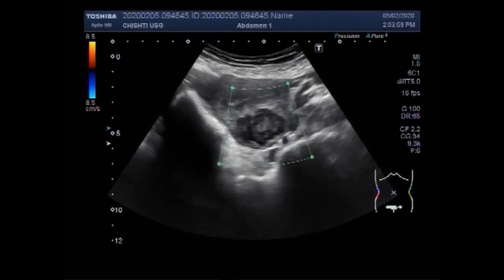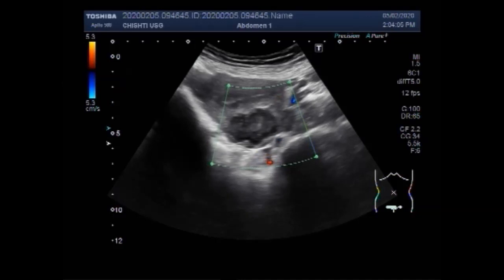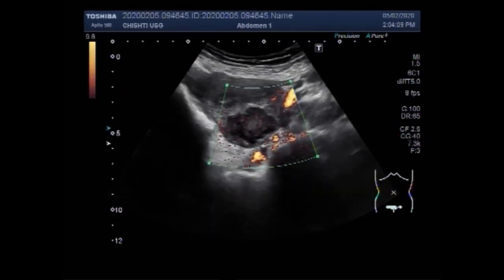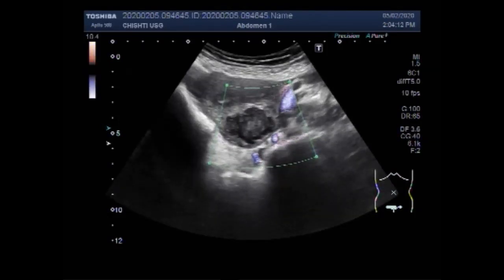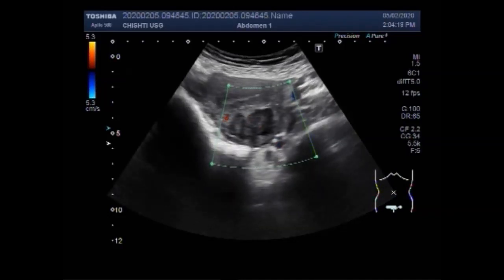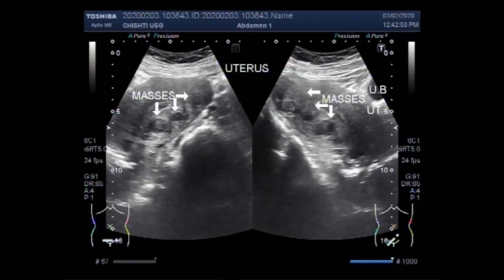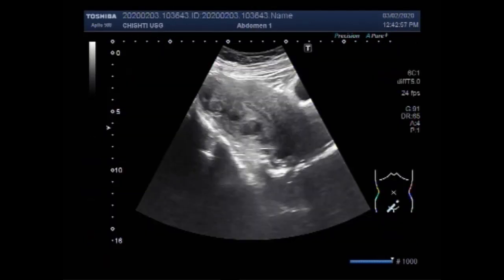Again you can see the blood flow in the mass. Just after a few seconds you will see the second video, which also shows multiple fibroids — multiple masses in the uterus.